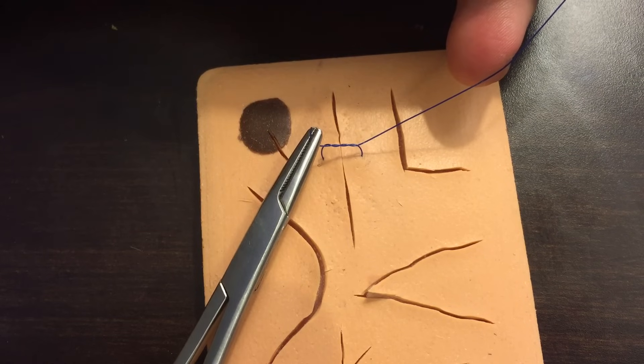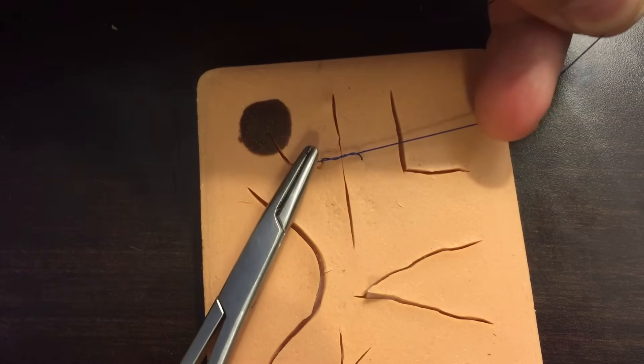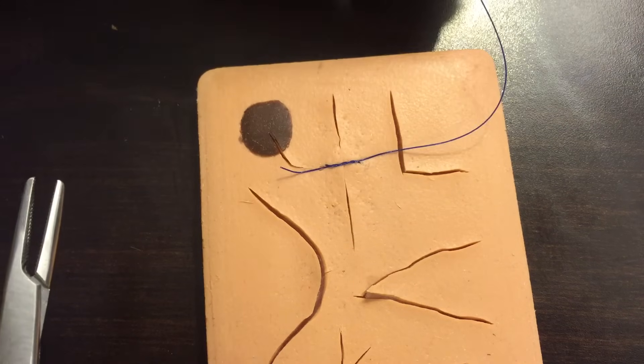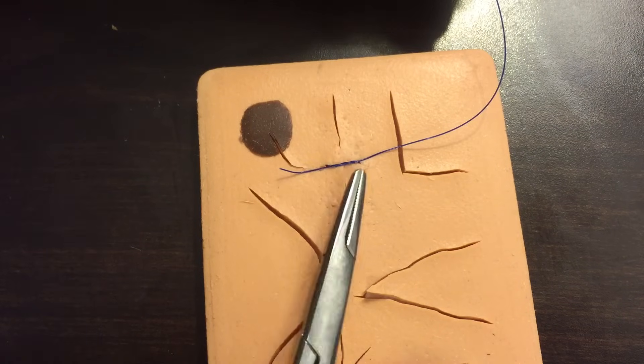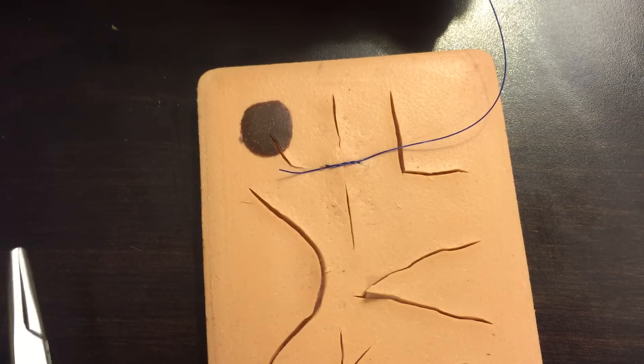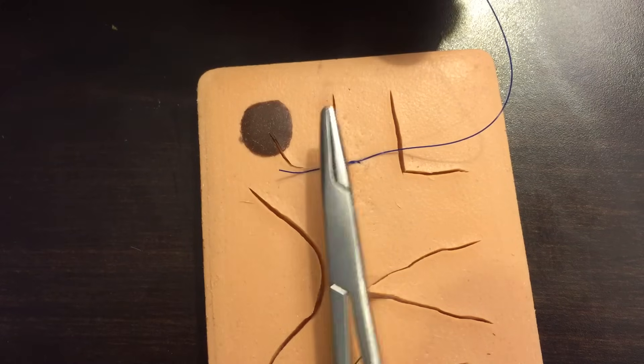Now I've got a double throw. Pull that gently down over the skin — not pulling too tight, just enough to approximate the skin edges. The double throw is going to help hold it in place rather than slipping out and losing your tightness.